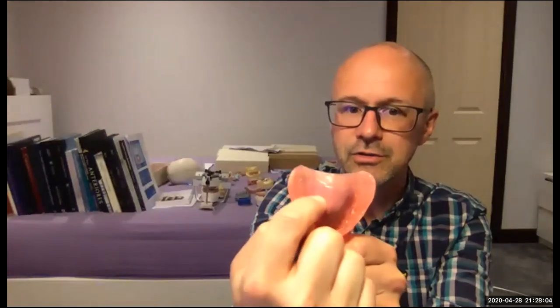I tend to find if the patient has a gag reflex, Isabel, that it's generally produced by this extension in the middle here. So I can compromise on this extension by bringing it further forward. But what I don't compromise on is around the back of the tuberosities. So we just swing it further forward there. And the way that I judge it is, obviously when I'm doing the impressions, if the patient's gagging, then I know that we've potentially got an issue. And then when we come to do the jaw registration stage, we've got a wax rim like this, and I'm prescribing where the teeth are going to go. What I do is, I'll trim out this back edge just there to the point where the patient's not gagging. And then we bring that post-dam forward on that. So that's how I assess that, Isabel.